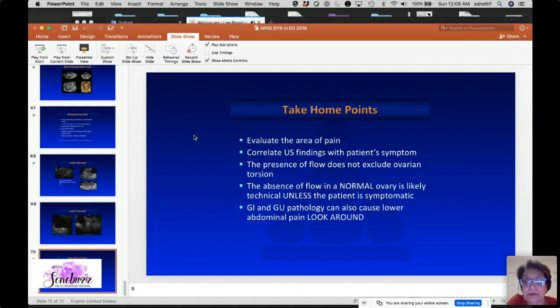Okay, ma'am. Thank you for that. Another question is if you could guide us regarding the PRF settings for seeing the ovarian and endometrial blood flow.